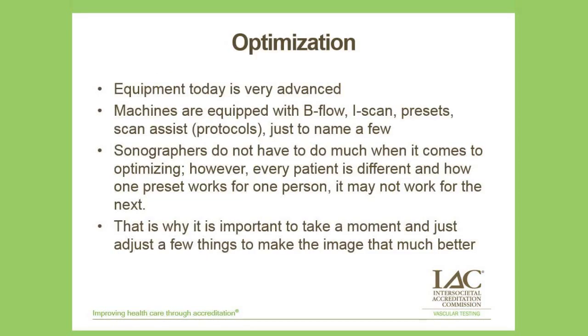So we know that today equipment is very advanced. Machines are equipped with B-Flow, iScan, presets, Scan Assist, just to name a few. So sonographers, we don't have to do much when it comes to optimizing. However, every patient is different, and how one preset works for one person, it might not work for the next.